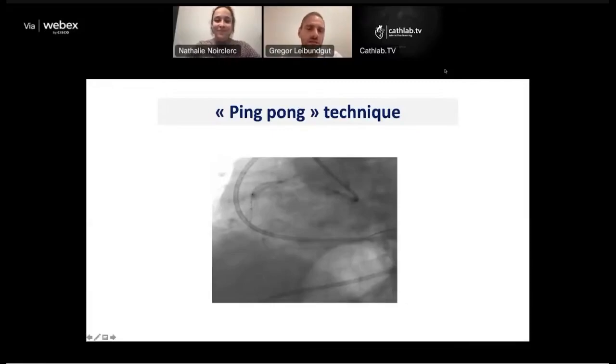I mean, it was a diseased vessel, but there was no calcified nodulus that you think could get pushed through the wall and rupture the vessel. The stent, I think 3.5 in a big RCA is not too big, especially since you put in a 3.0 and took a non-compliant balloon. So I think a lot of people wouldn't have expected a perforation. I would probably also have retrieved the balloon.